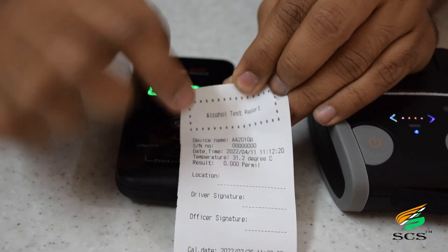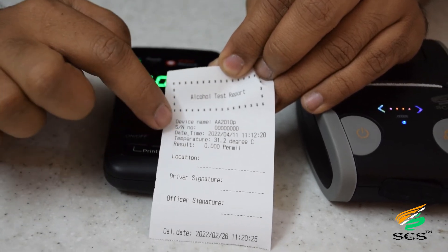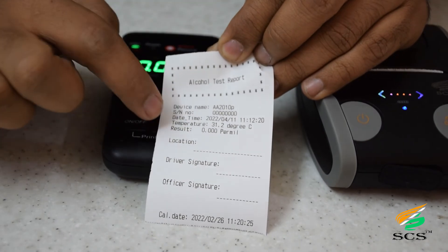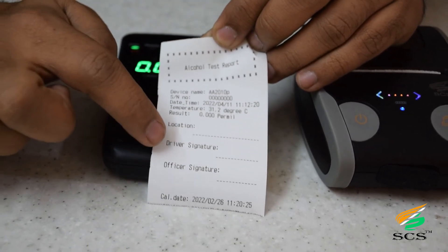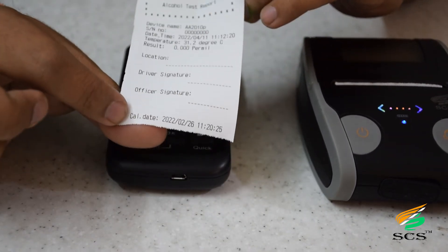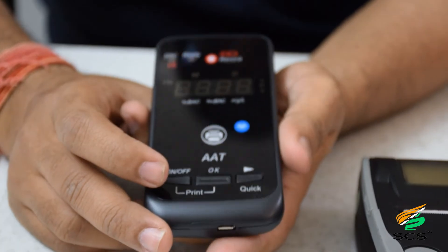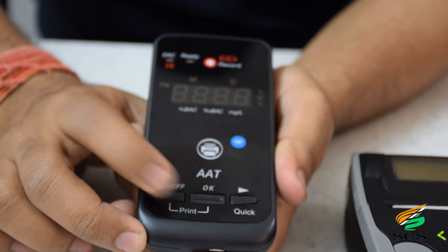The print receipt shows many details: device name, serial number, date and time, temperature, result, location, driver signature, officer signature, and last calibration date and time. It is a predefined format that must be filled in by hand. Now we are taking the passive test.